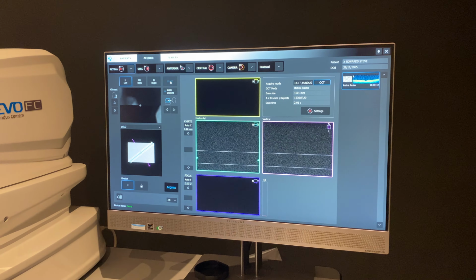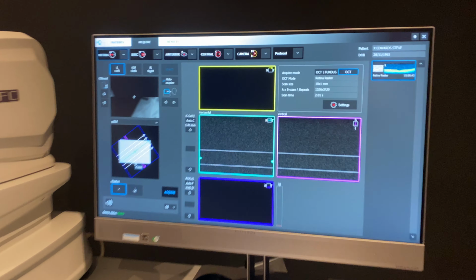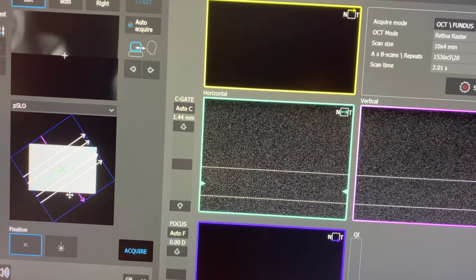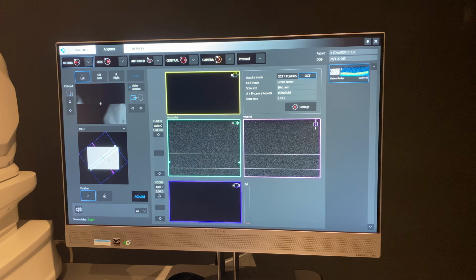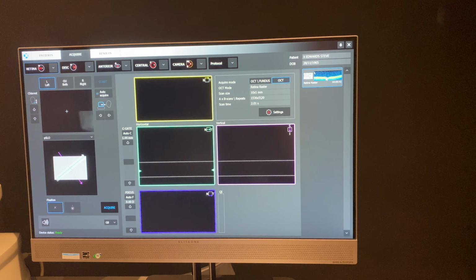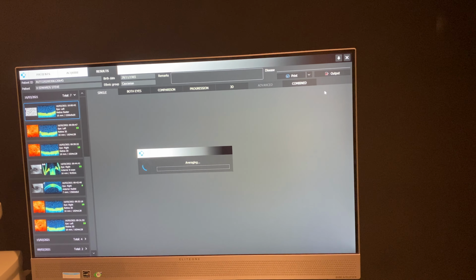I mean, you can change the gap. So they're the 1 millimeter raster lines. They're 1 millimeter apart. You could change them to 4 millimeters. But the chances are you'll then go either side of the pathology that you saw when you scrolled through the 3D image. But that's quite a distance when you're scanning an OCT. So we now should have 5 images only. No clinical data about retinal thicknesses. We asked for image only.